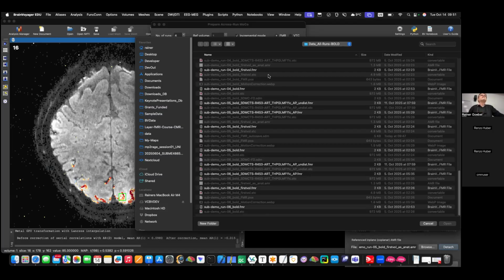If you want to show them the motion of one run, I think it's nice to also show. No, I first want to show them the new tool because we do it before. We do it before to plan, and then we look at the runs. That's why I want you to open all 6 runs, even if we later on average run 3 to 6 and work with that, because it's the same protocol. We can just average them.